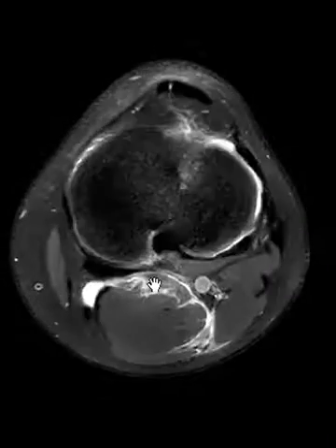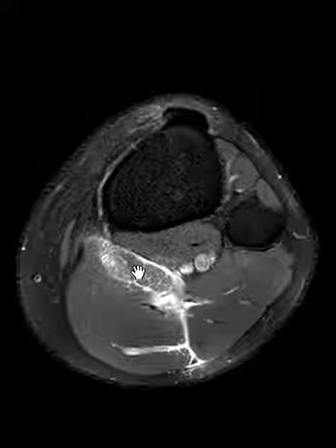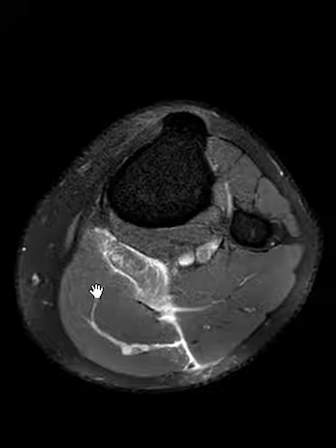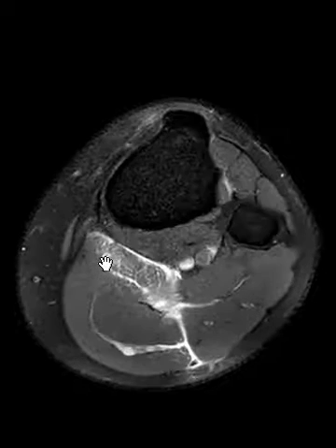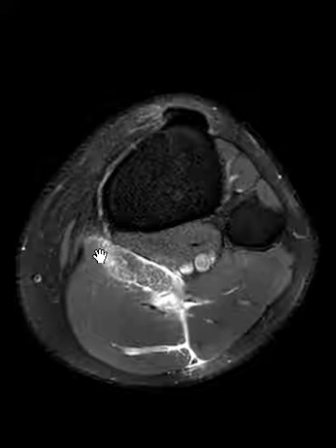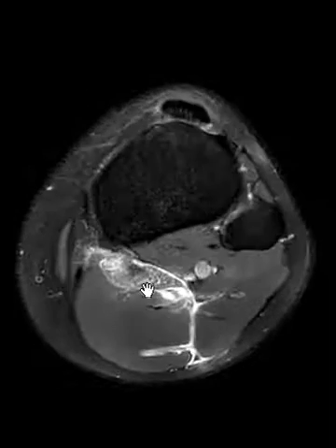It goes back here between the gastrocnemius muscle belly. This is the plantaris muscle — it's variable, it's not in everybody, and you usually don't even see it, it's so small. It blends with the gastrocnemius muscle and you can't see it as a distinct structure unless it's injured. It's a very small tendon and small muscle, and in this patient the muscle belly looks bigger than usual.